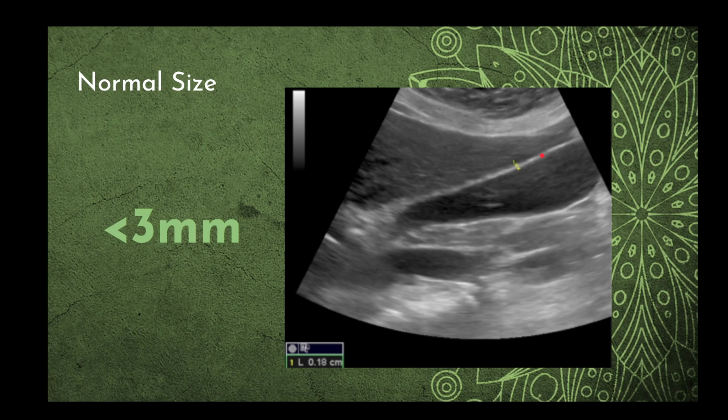Another thing you need to know about the gallbladder wall, when you measure it, you must measure somewhere on the anterior wall. And I'll point it out when we go over the protocol. But you must measure somewhere on that anterior wall, never on the posterior, never on the side. You can see that we're kind of losing our wall here. We're not getting those clear defined borders.